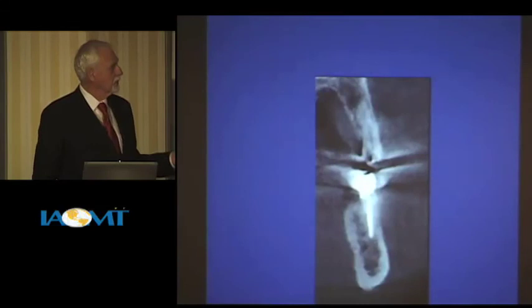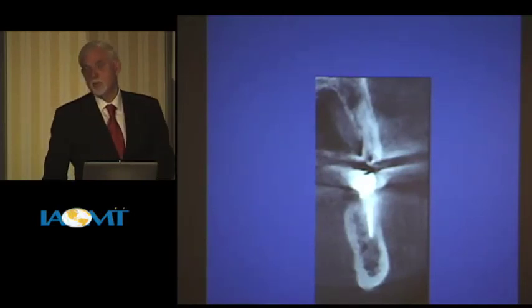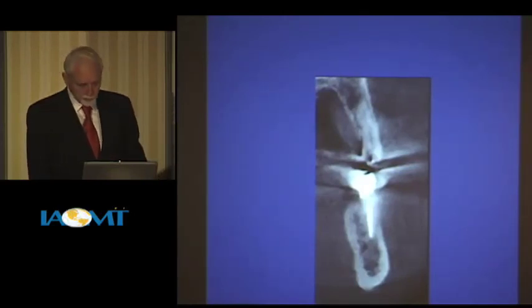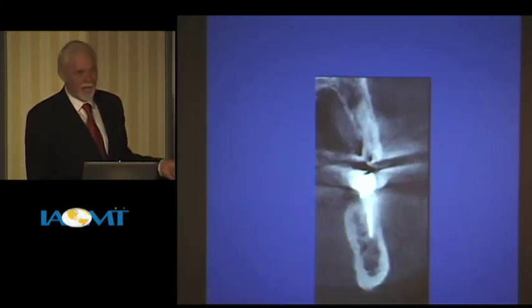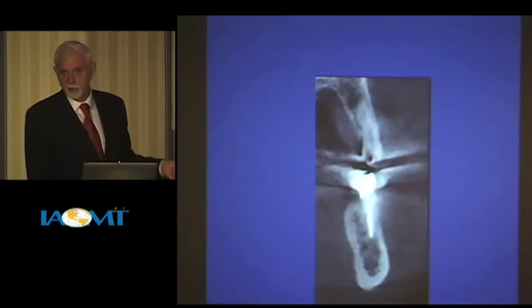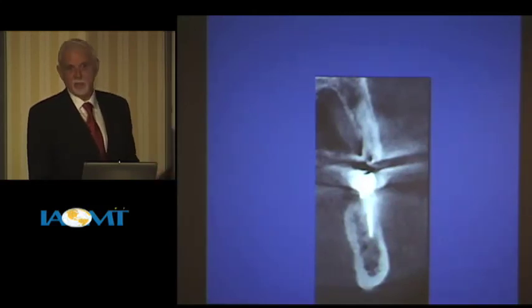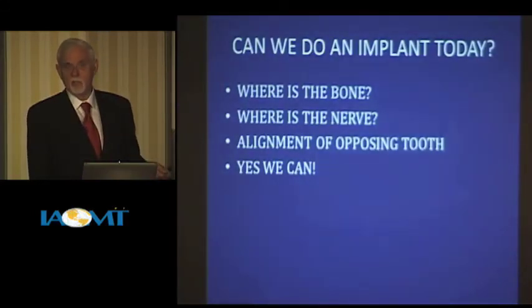This is one of our patients that came in. We decided together that we were going to do an extraction on that tooth. So she shows up in the office and she says, "Oh, by the way, can you put an implant in today?" It was not scheduled, but look at this. How difficult is that? The nerve's way down here, plenty of room, not a lot of infection. I did that one. I don't do that very often, but it has some amazing ability.